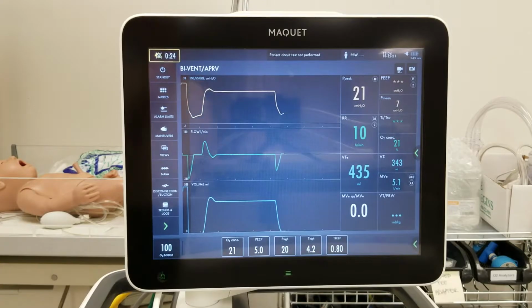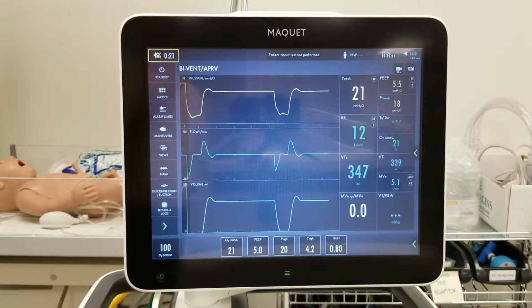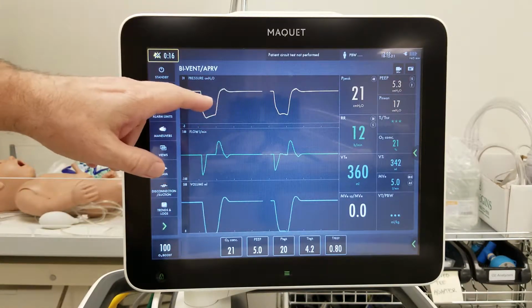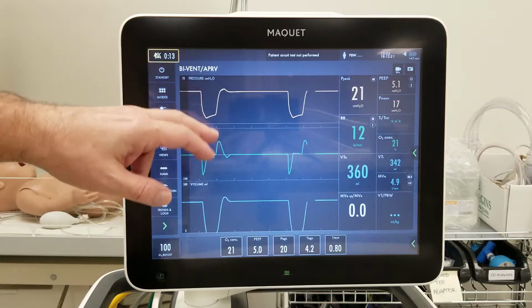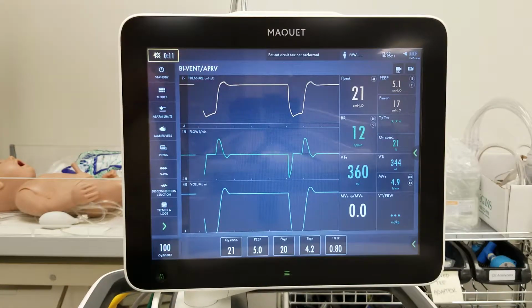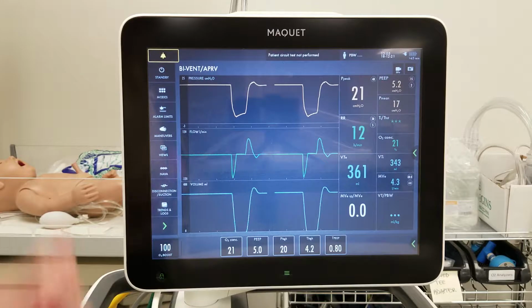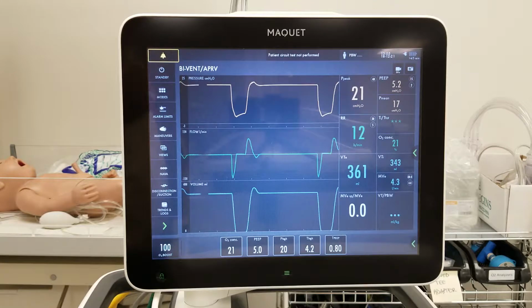Now let's see what happens. With those settings, do we receive what we need? So first, let's just look. Notice it's airway pressure release ventilation, APRV, because most of the time we are set at this high level of PEEP where the patient can breathe at any time. It's just an inverse ratio pressure control type of breath, but the patient can breathe at any time at that high pressure. We release that volume for the pressure for a very brief period of time, which allows the patient to breathe out, and then we go back up to P high.